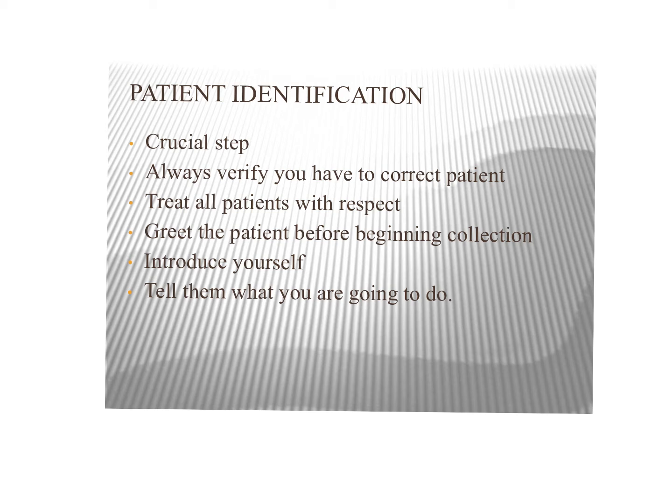We want to greet the patient before beginning the collection. We never want to just go in, get everything set up, and then grab for their arm and start drawing. We want to interact with them. We want to greet them.